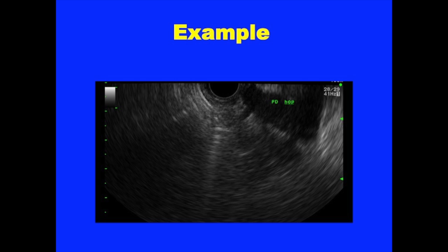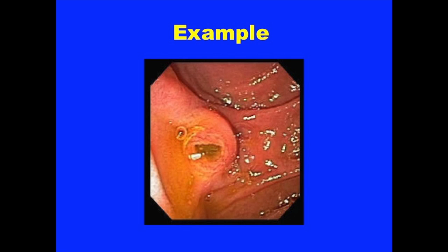So in this person, it does not make sense for that to be chronic pancreatitis and to have that duct dilated there. What we are seeing is actually that this person has a classic fisheye appearance to their papilla, and we are seeing the duct come out right at the orifice of the papilla and extruding mucus. This was a main duct variant of IPMN.